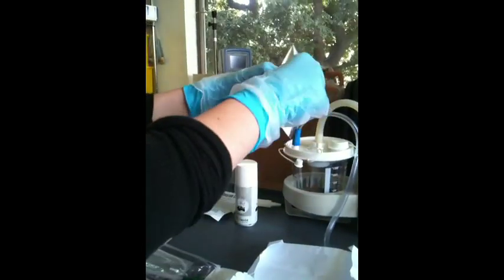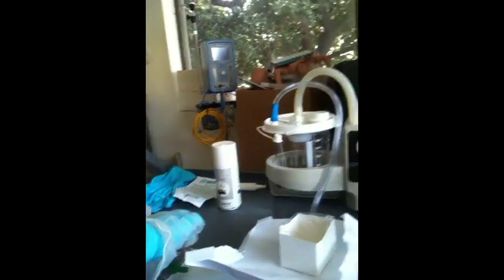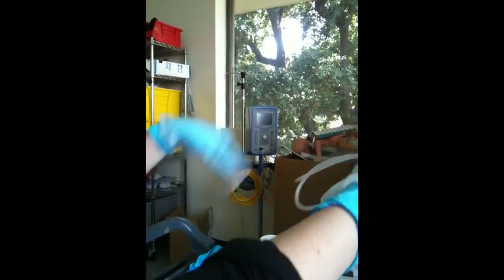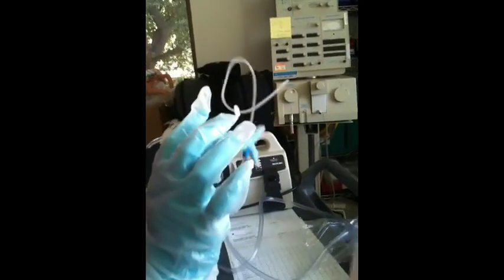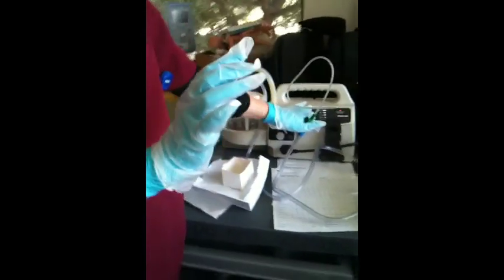Now we're going to open our basin, which is what we will use to put sterile water or saline in. And next, our catheter. Clean hand, dirty hand. So now we just connected our catheter with our suctioning source, and we're going to turn it on.